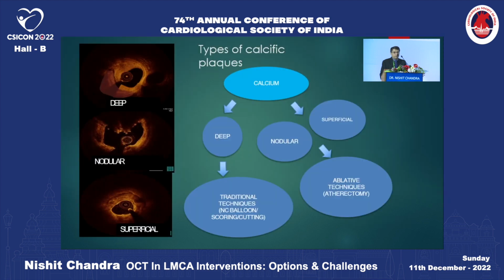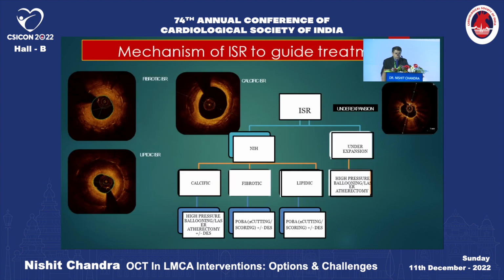Especially in the calcific lesions, because with IVUS the sound does not penetrate calcium, so we don't get to know the depth of the calcium. The light penetrates, so OCT can define how many microns thick the calcium is, whether we should be using any debulking device or not, and if we are using, which debulking device we should use. And one area where OCT is paramount is in-stent restenosis, because here it is very important to ascertain the mechanism of the ISR, whether it was an underexpanded stent, whether it was a malapposed stent, or whether it's a neointimal hyperplasia or neoatherosclerosis.